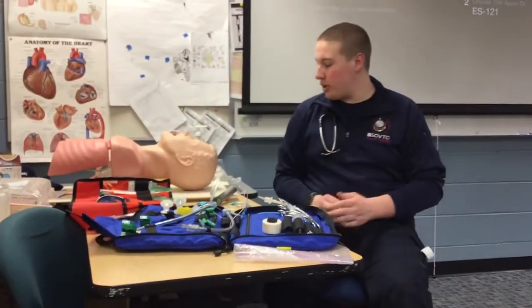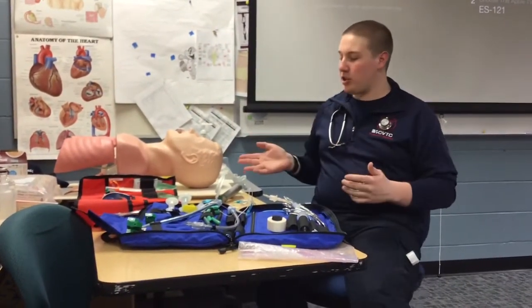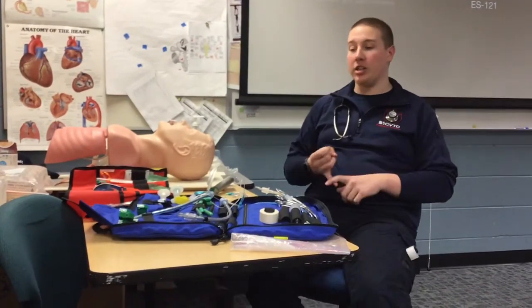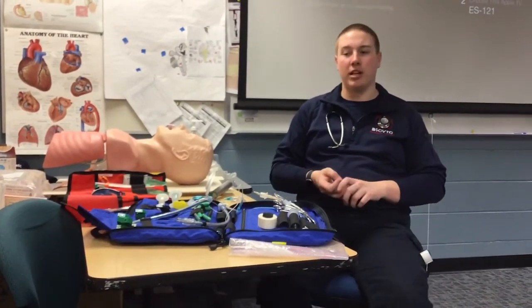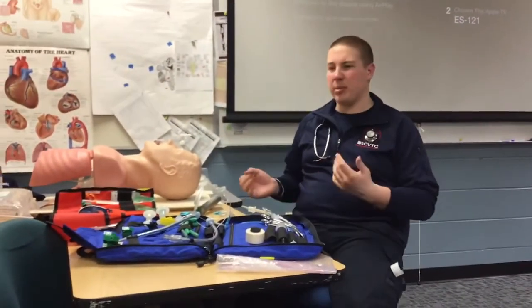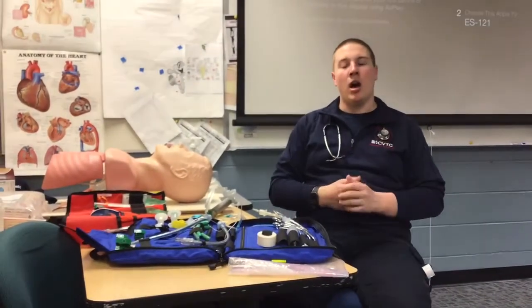All right, so today I'm going to be intubating this patient. Before we start, I'm going to go over some information about intubation. So indications for intubation would be unconscious patient, patient without a gag reflex, GCS less than 8, a patient in cardiac or respiratory arrest, patient not able to maintain their own airway.